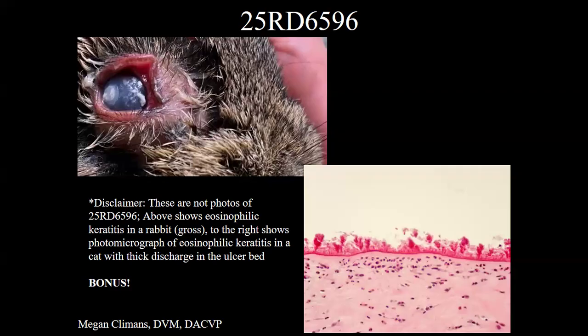They described that during surgery, this was a very vascular mass. They had to use a lot of cautery and ligature, and they asked us to read this one ASAP because they were worried about cancer and wanted to know if they should start additional treatments quickly.